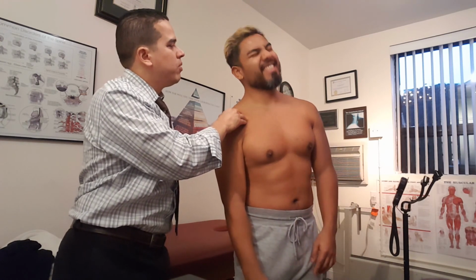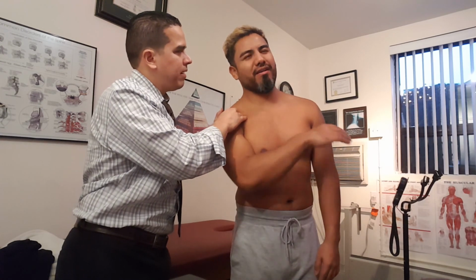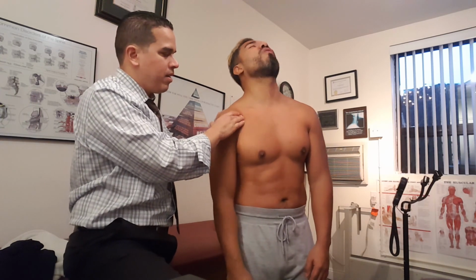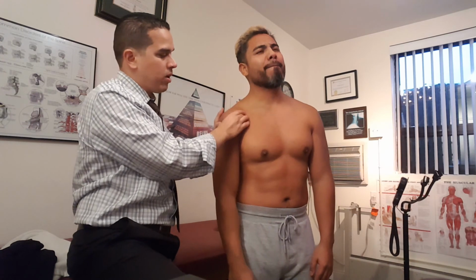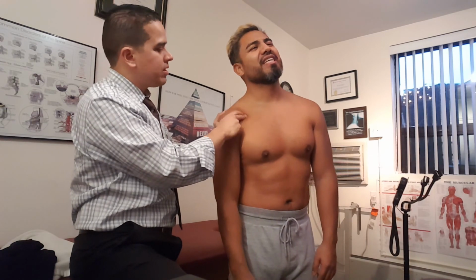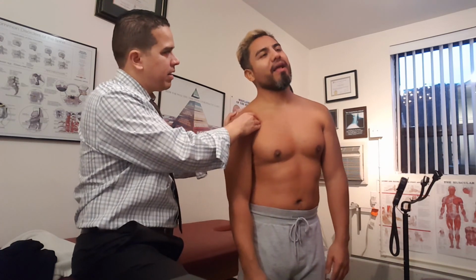You're feeling when you move the shoulder in, right? Yes. So when you're gonna go grab inside, you feel that pain right there. Yeah. Okay. So this is where the tissue and the muscles are dysfunctional, right in this area. So we're gonna get to work. I'm gonna work in this area. We're definitely gonna do some pressure points today. But this is the last bit, exactly what you're talking about. The last little bit, right in that section. Okay. Almost there.